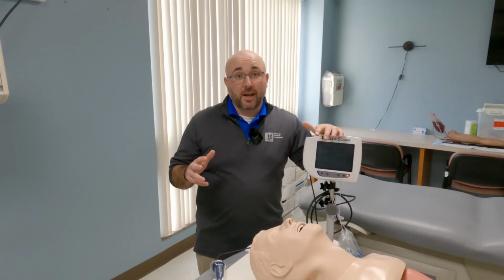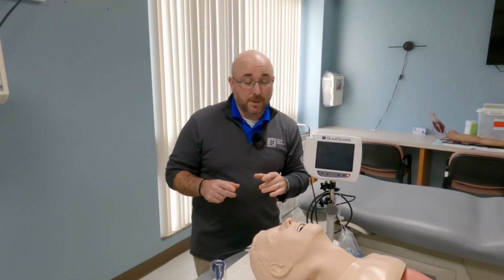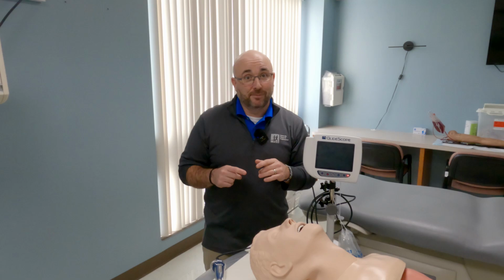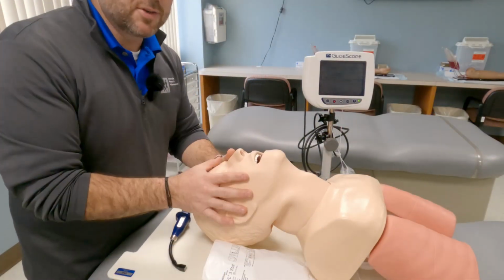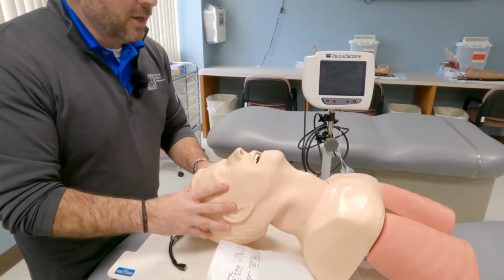There are many on the market, but when you go to intubate the patient with this, it is not the same technique as direct laryngoscopy. There are a couple key points that you need to follow so that the endotracheal tube gets to the right place as quick as possible. Let's take a look. I've got you up close here on Fred the Head, and we're going to show a little bit about how to use video laryngoscopy.